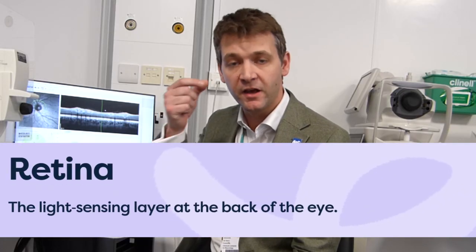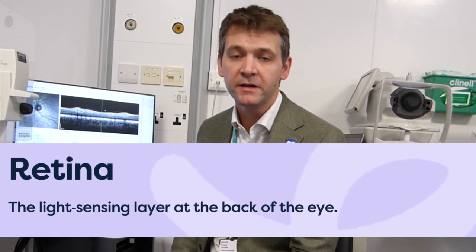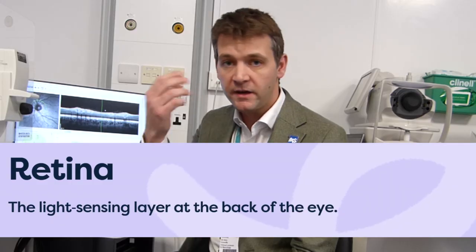This is a really commonly used test that is often found in high street opticians. What it uses is light to measure the cross-sectional structure of the retina, the light sensing area at the back of the eye. We can use a light stimulus and quantify the reflection of that back from the eye to segment and look at different layers of nerve fibers at the back of the eye.